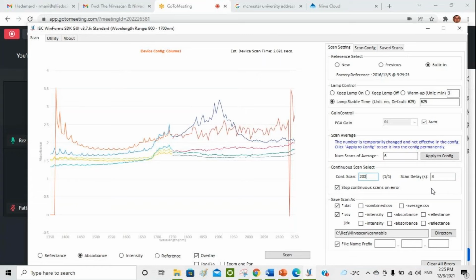Give it time to record properly, because if you rush it too much, there may be some overlap and it may not work properly. Yes, try it. We tried it, we figured it out, but we have a lot of peaks, ups and downs. I don't want to do it too fast.